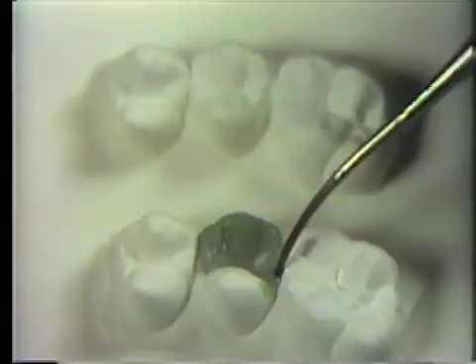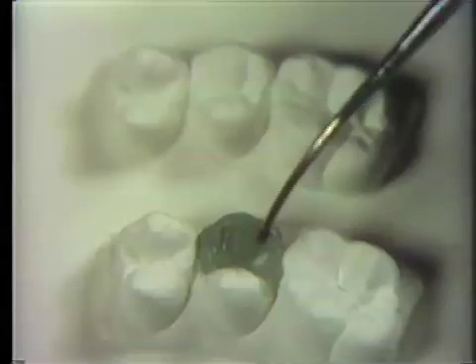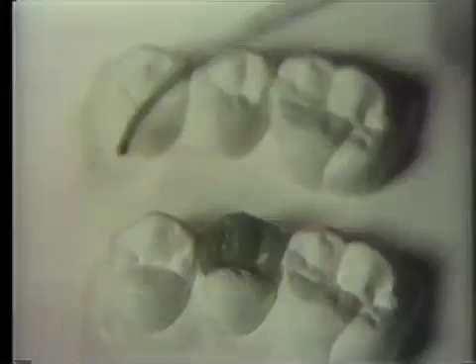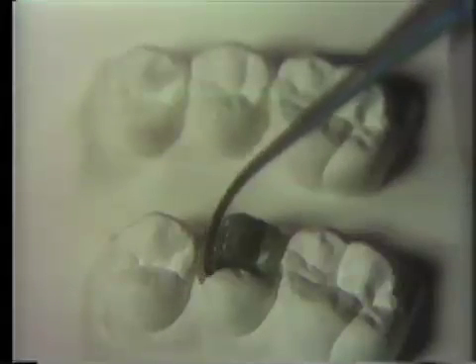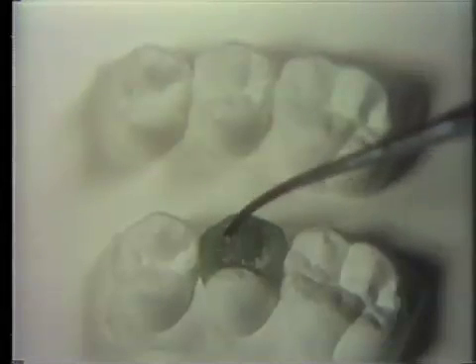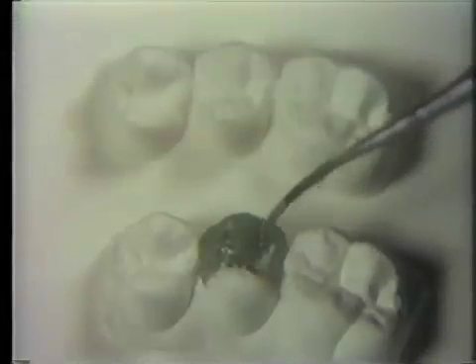Marginal ridges should match in the curvature and height of adjacent marginal ridges. Fissures are finally burnished with the blunt end of a PKT-9, following each fissure in turn until every detail is complete. Zinc stearate is frequently used.